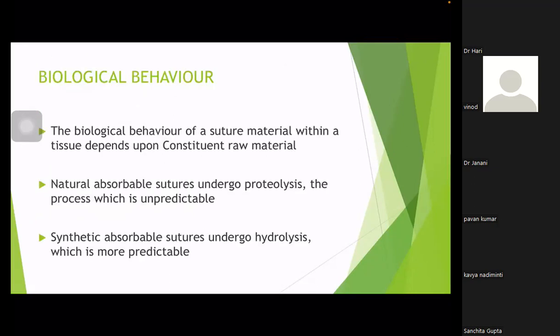Biological behavior. The biological behavior of suture material depends upon the raw material from which it is made. Natural absorbable sutures undergo proteolysis, which is an unpredictable process, and synthetic absorbable materials undergo hydrolysis, which is more predictable.